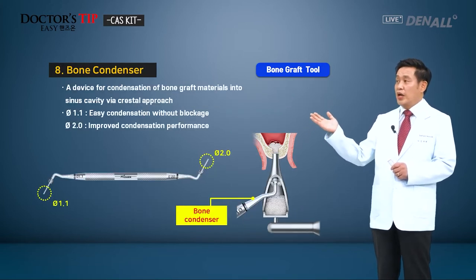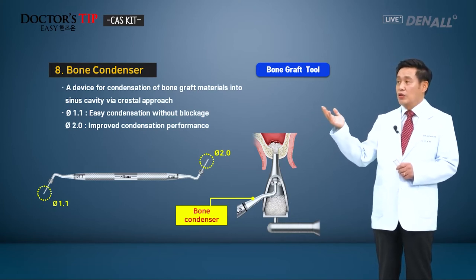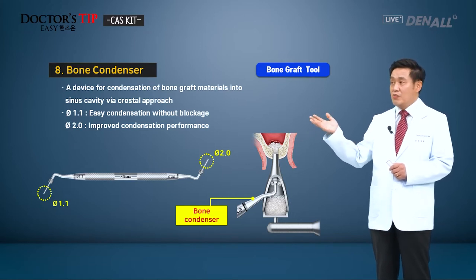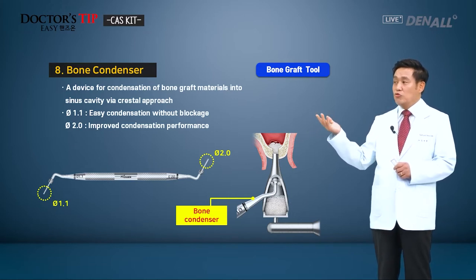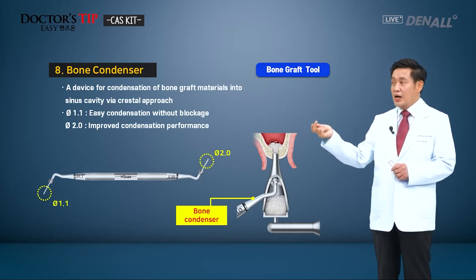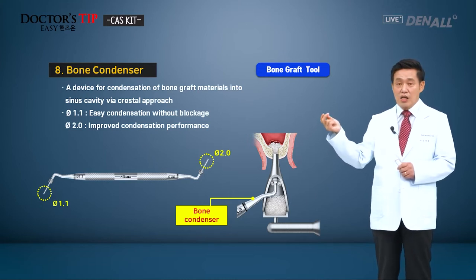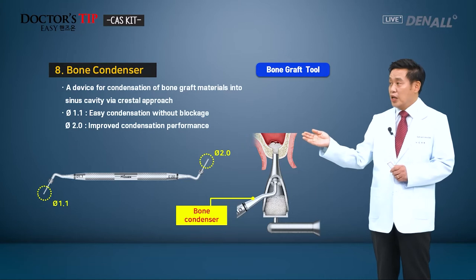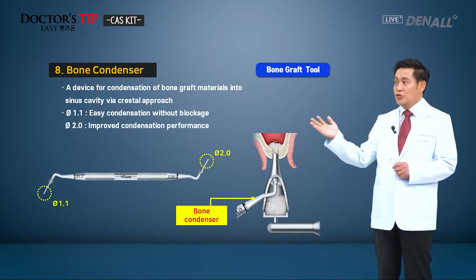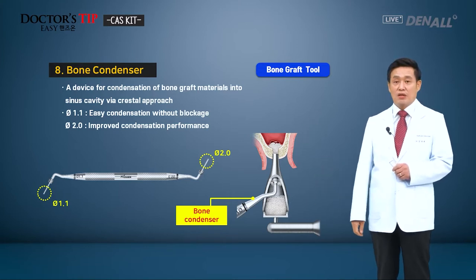Next, the bone condenser. Bone material is put into the bone carrier and hydrated. There are two diameters for the bone condenser, 1.1 and 2.0. 1.1 is used when bone graft material is blocked, to prevent that, to push it up continuously. Diameter 2.0 is used to lift up more bone materials.